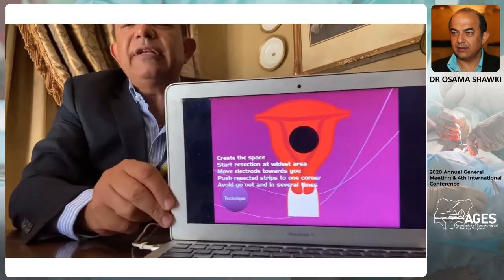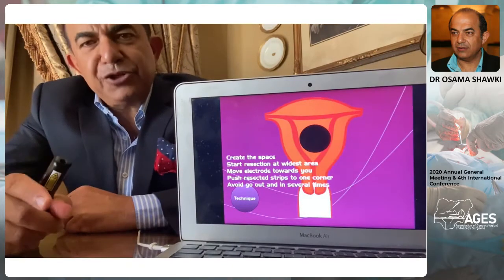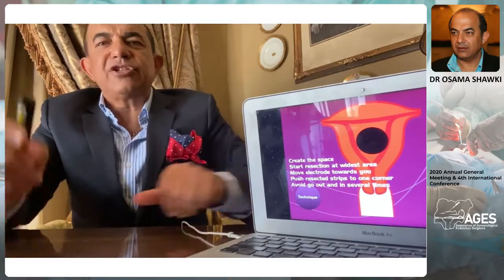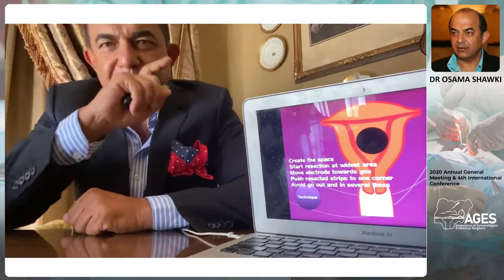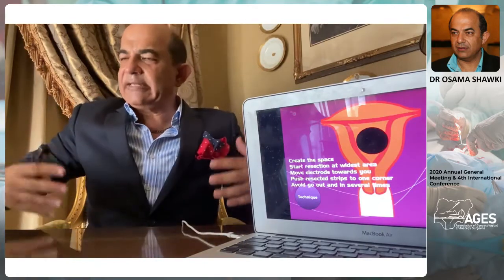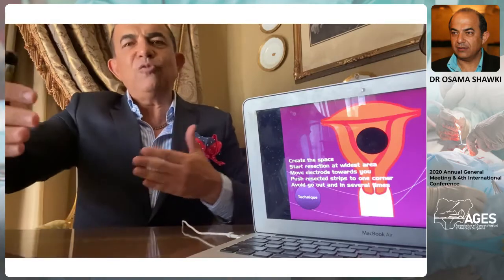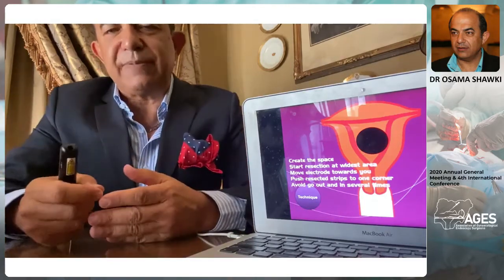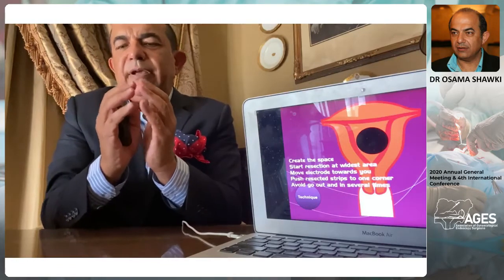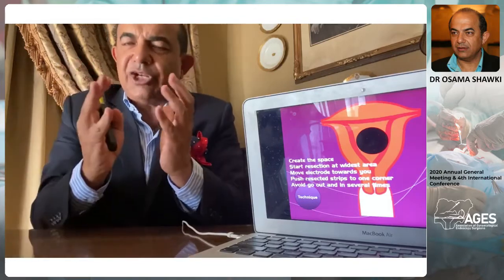Myoma resection requires certain preparation and certain situation. It is not like laparoscopic myomectomy. In laparoscopic myomectomy, whatever the size of the myoma, you can still insufflate the belly more, and you can find the space left and right to move around and to do your surgical steps. But for the submucous fibroid, if the myoma is a little bit big, there is no space left and right. The uterine walls are already touching the myoma.